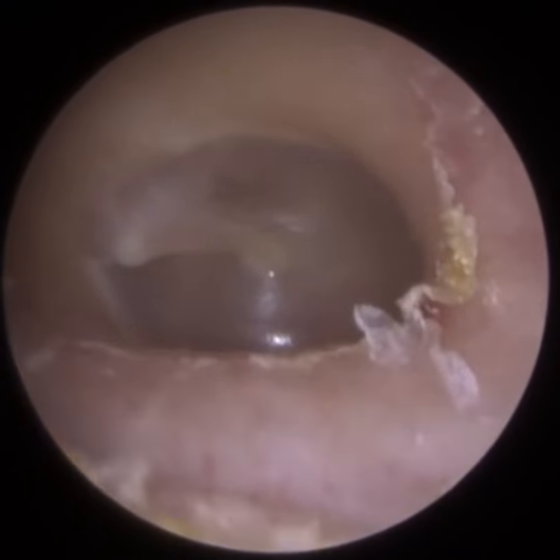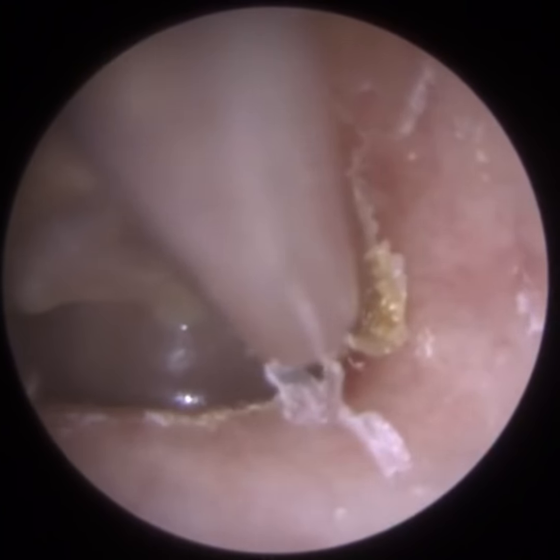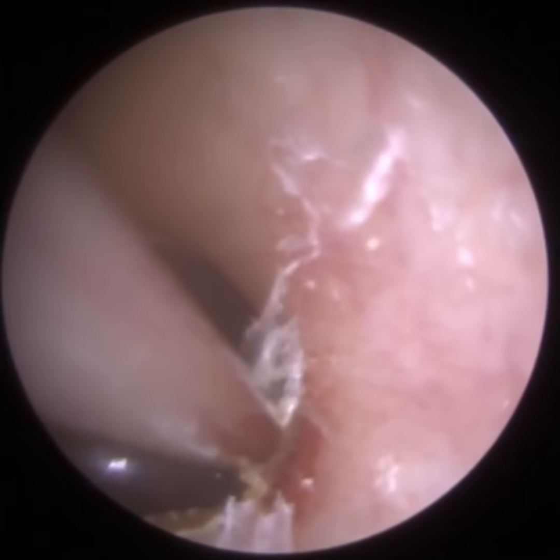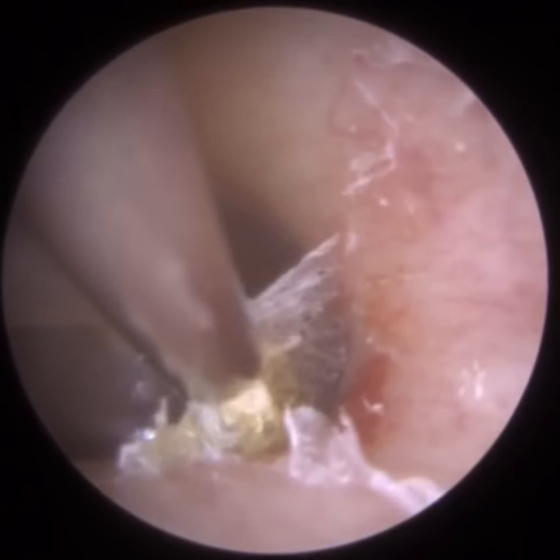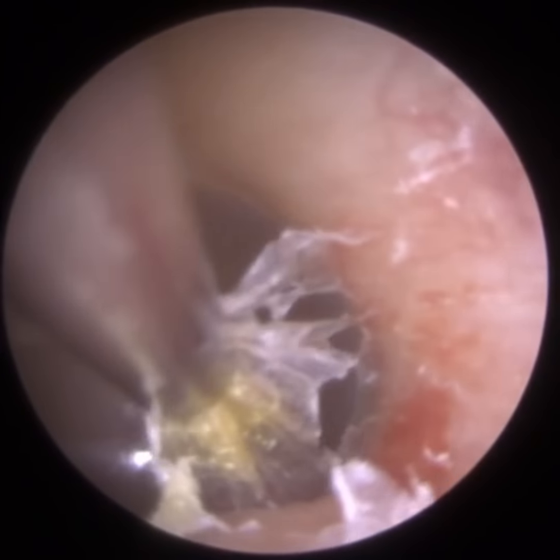So the skin, it's really tightly adhered. It is dead. It's not going to really move on its own accord. We know that the patient does suffer from otitis externa. They do get this natural buildup of skin in the ear. It's just causing them irritation, so we're trying to remove as much as possible. And this is that trail of skin. You can see I've just got onto it and just trying to bring it off. Some blistering there. That's quite normal when we remove skin because it's so tightly adhered to the canal wall.